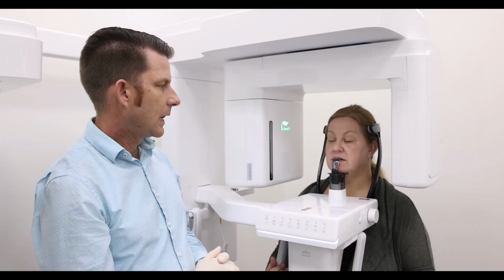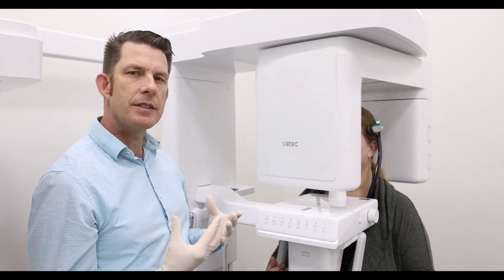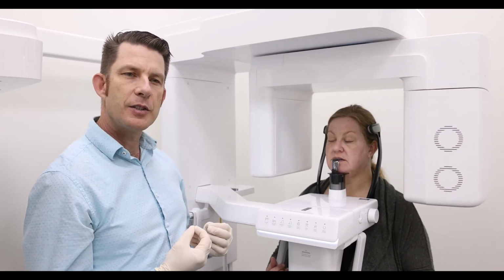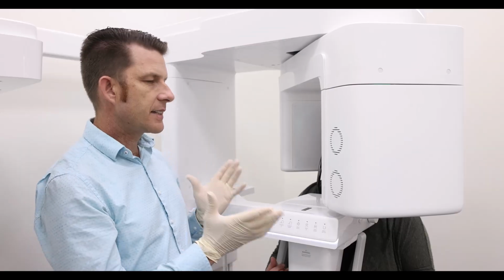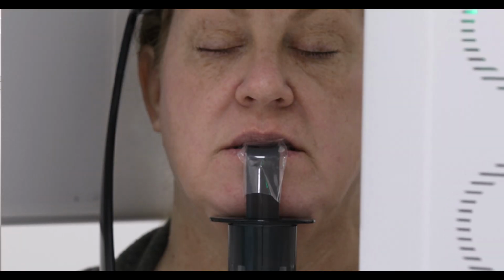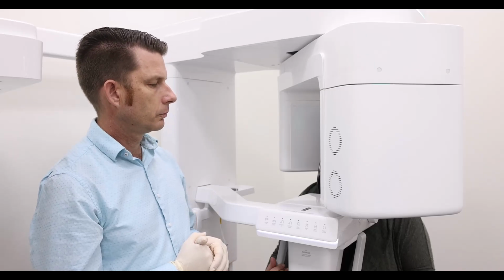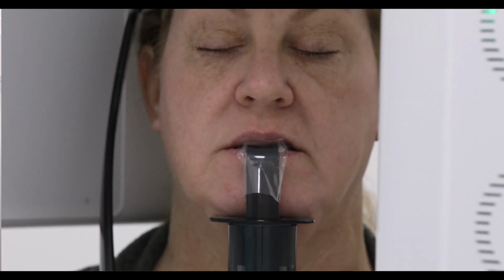Please wait. When capturing your CBCT, it's very important to make sure that the patient does not move and remains as still as possible. Once this gets into position for capture, it will also tell the patient to close their eyes. The system is ready to capture an image. Please close your eyes until image capturing is complete.